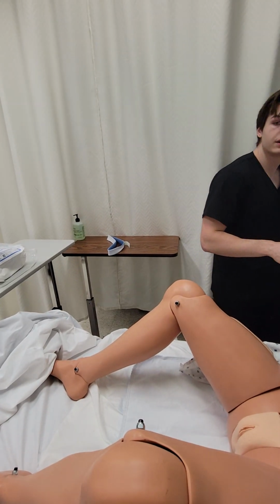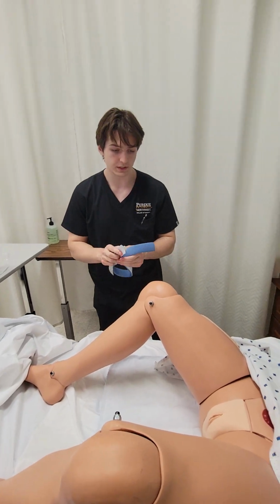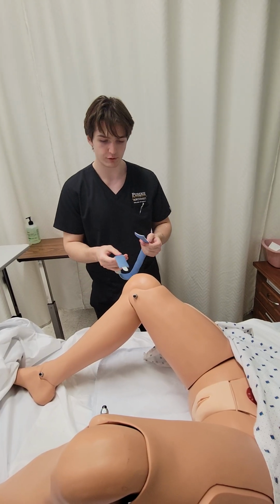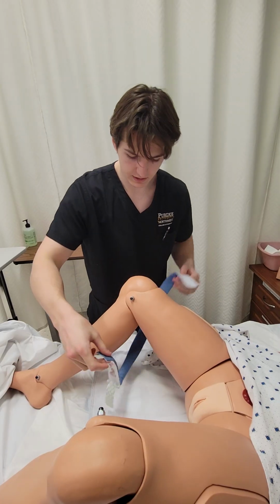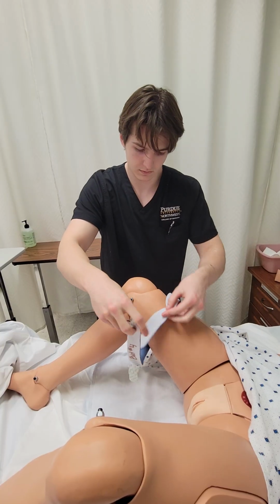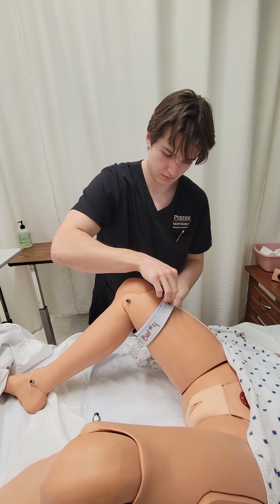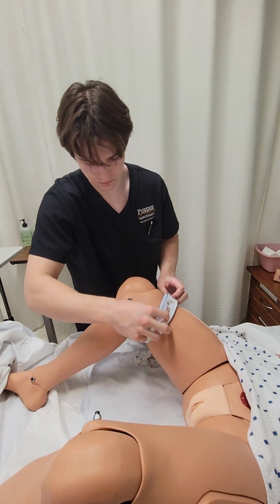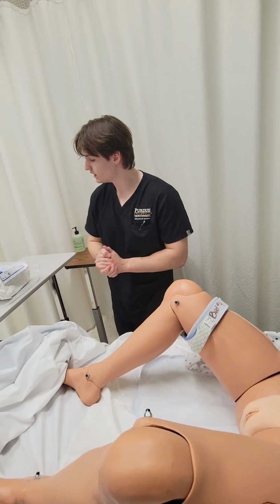Alright, so now we're gonna prepare for the Foley catheter itself. There can be some discomfort in this procedure, and if you do experience any at any time, feel free to let me know. I'm going to apply this in advance because I find it easier to be done that way. Okay, now to move on to the Foley catheter.